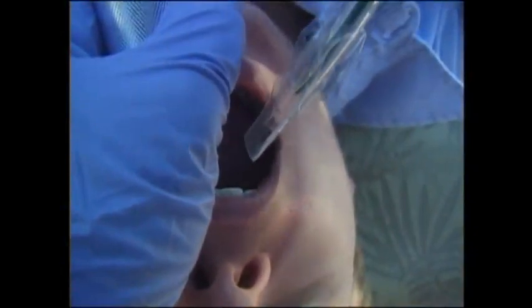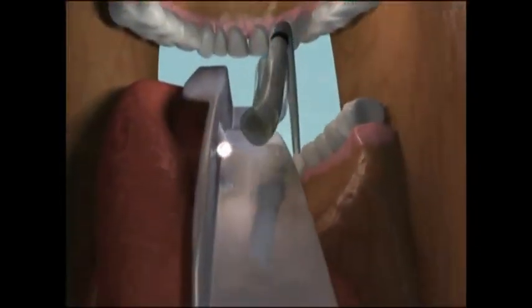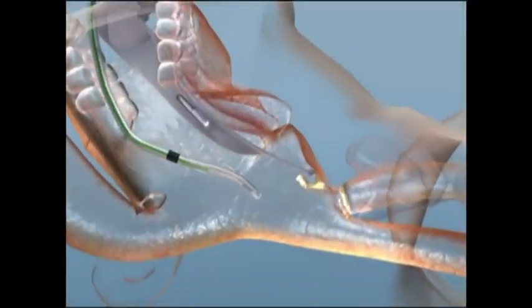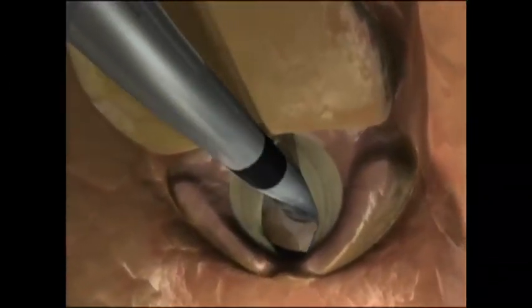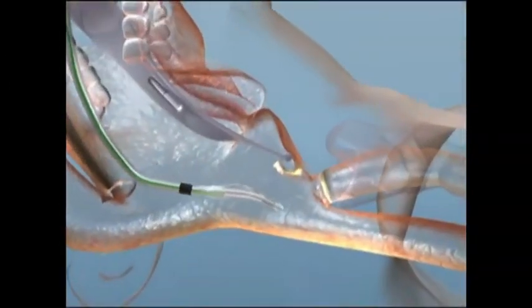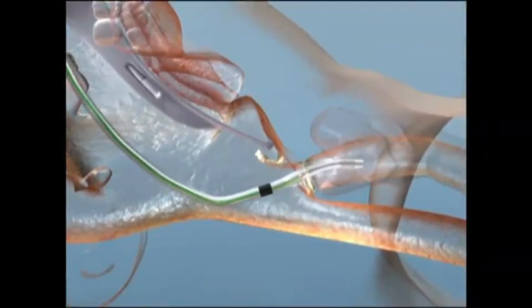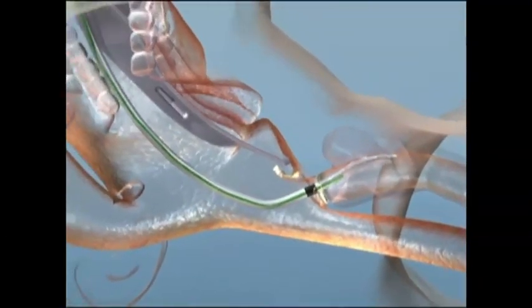With your right hand, advance the ET tube starting at the right corner of the patient's mouth and direct it towards the midline. While directly visualizing the vocal cords, pass the ET tube gently through the glottic opening until the cuff disappears beyond the vocal cords and then advance it another 1-2 centimeters.